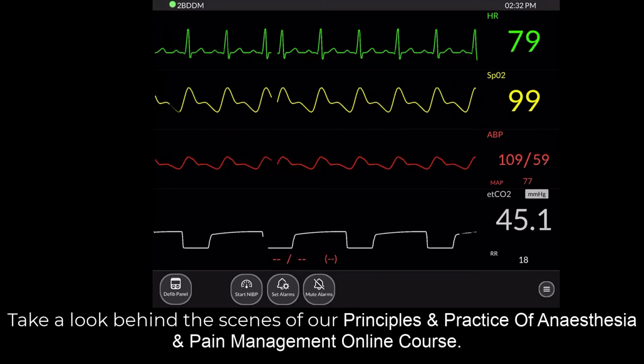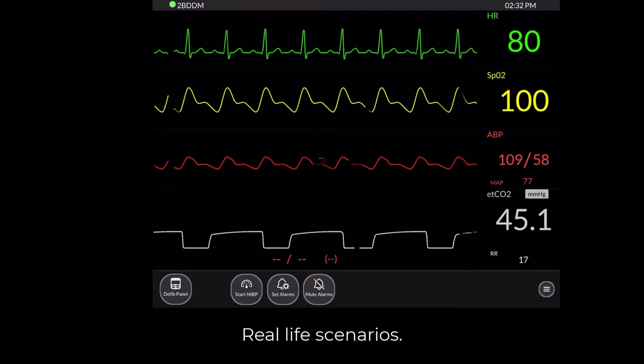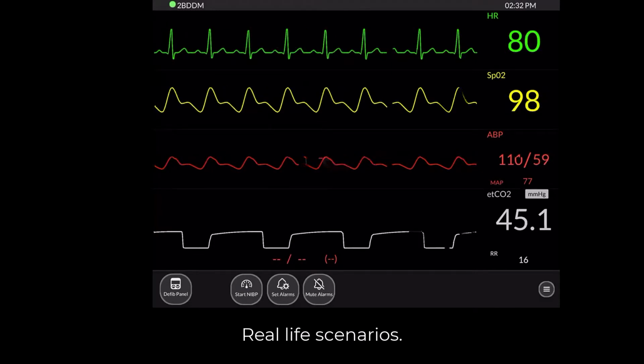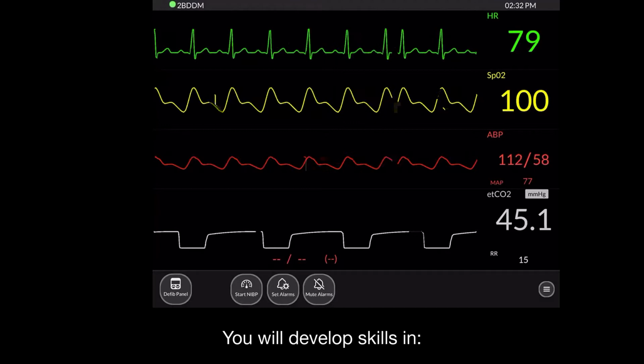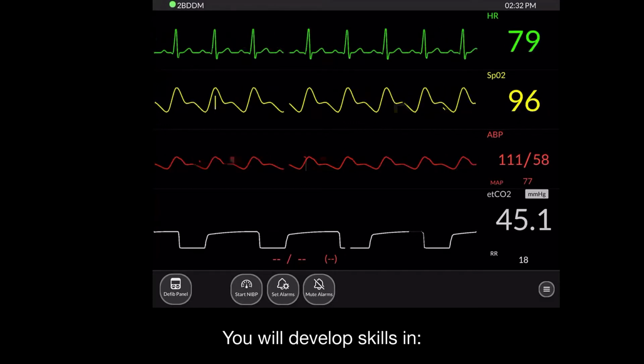The last graph is the end-tidal carbon dioxide, EtCO2, and is at 45 millimetres of mercury. So ask yourselves, based on what's normal, based on what we've talked about, what are those numbers doing? And this is the one I'm walking you through. So they're pretty tickety-poo, aren't they?